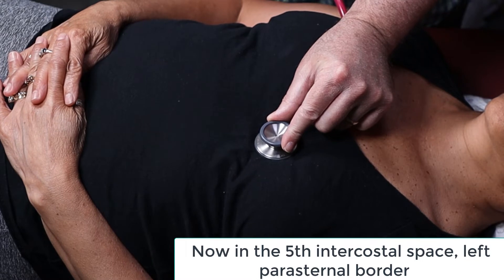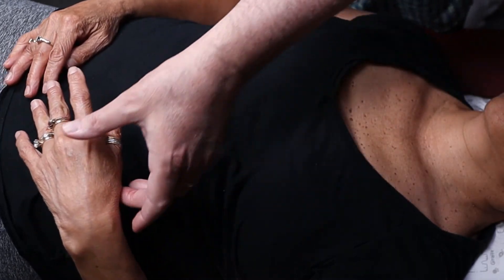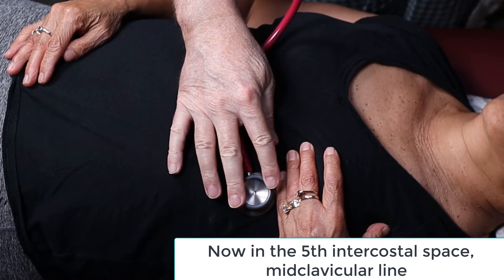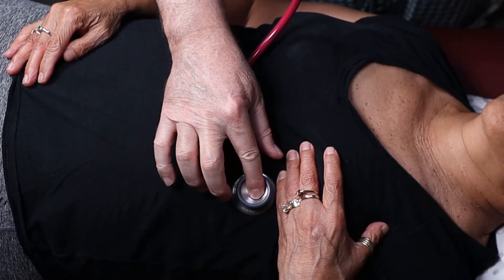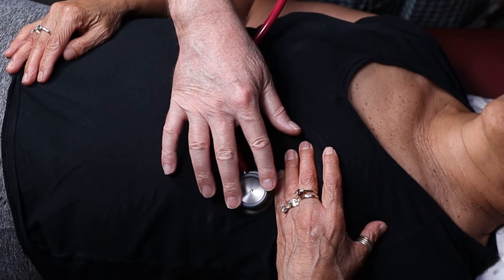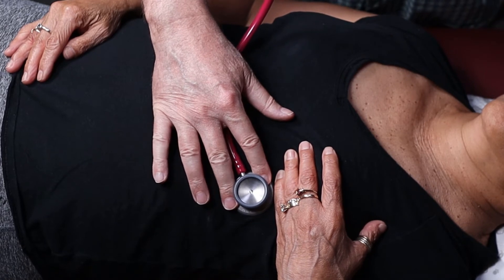Now to get to the mitral area, on this particular patient I'm going to have her pull her breast tissue out of the way — could you cup your breast tissue and pull it up toward this shoulder? Perfect. The mitral area would be right in this area. These are the auscultation areas. Don't hold the diaphragm like this with your finger — points off. Old stethoscopes, you might be able to hear a pulse through your own finger. Just in case, make sure you're touching there or angle down like this.